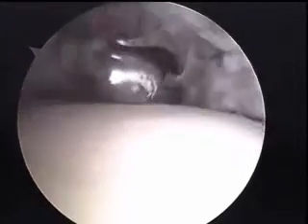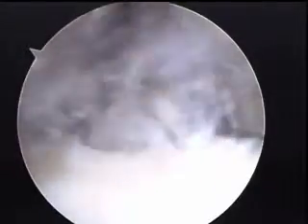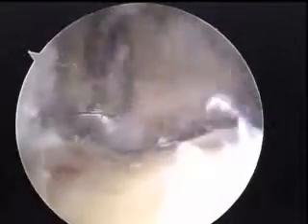And again, we're extending the hip just enough. Now that the burr is on, we're going to take our demarcating line here. Basically go through the cartilage down to the bone. And throughout this, while I'm doing it, we'll have fluoroscopy, or the special X-ray, taking some shots to make sure I'm getting enough bone and getting it in the area that I want. You'll see we'll come down quite a bit all the way to the side. We'll start maneuvering the hip, but I really want to take quite a bit of bone off here because we have quite a bit of impingement, as we've seen on our preoperative planning.